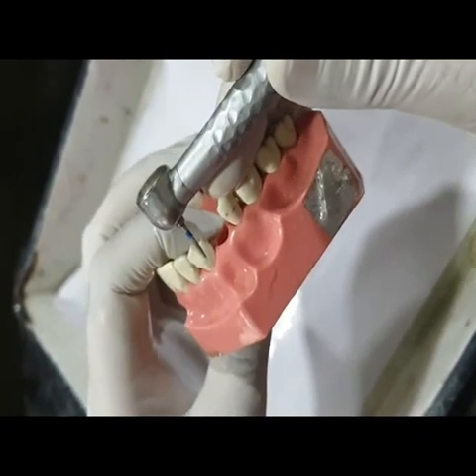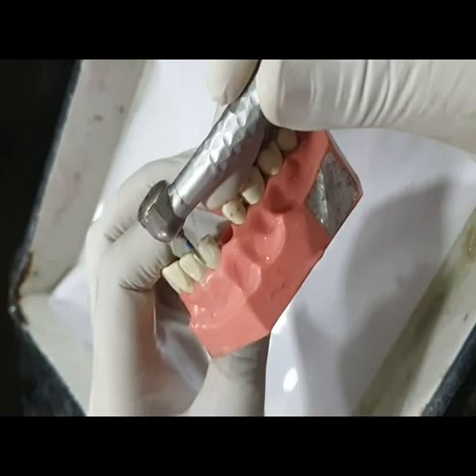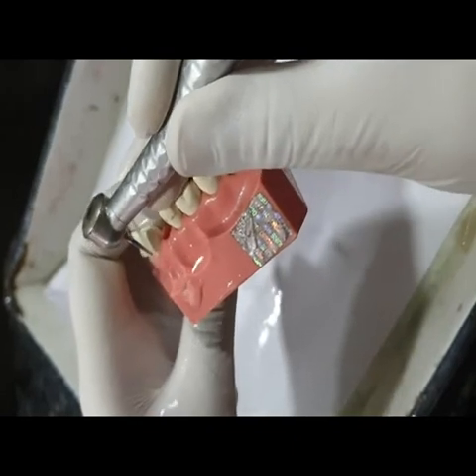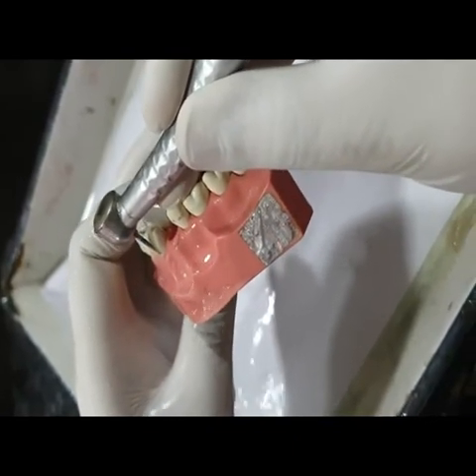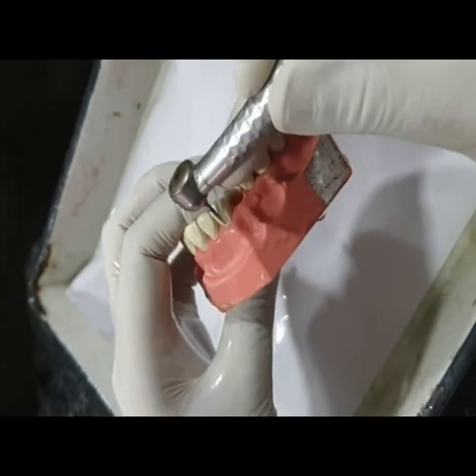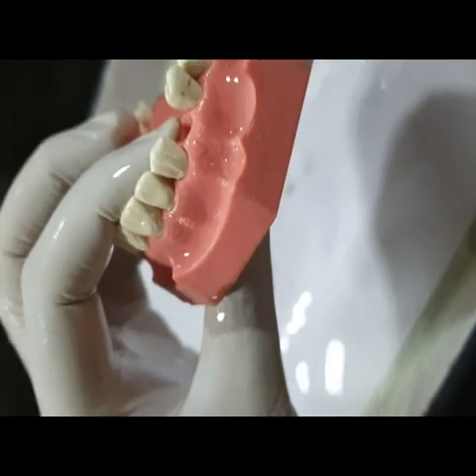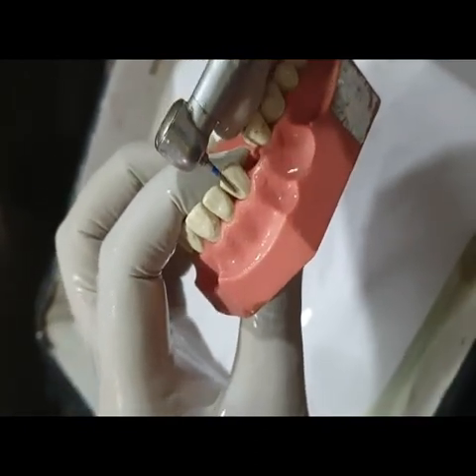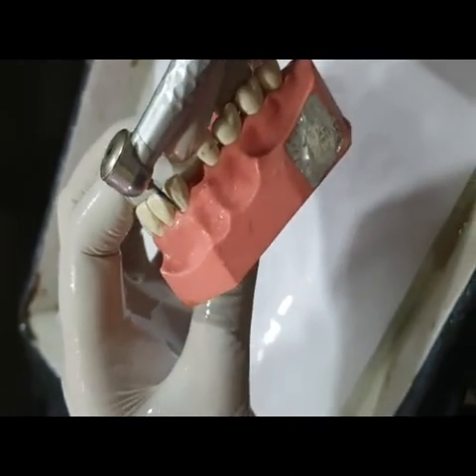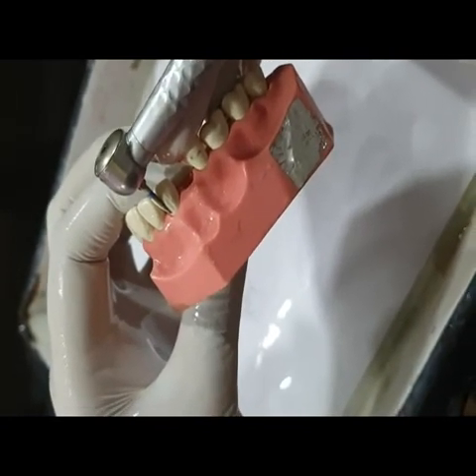For doing this, first we give the depth orientation groove in the incisal two-third region at a different angulation, followed by changing the direction of the bur and giving the cervical depth groove parallel to the long axis of the tooth. Once you have given these depth orientation grooves in two planes, your tooth will look like this — the incisal two-third reduction at a different angle while the cervical one-third is at a slightly different angle. By doing reduction in both these planes, you will achieve a biplanar reduction of the labial surface.